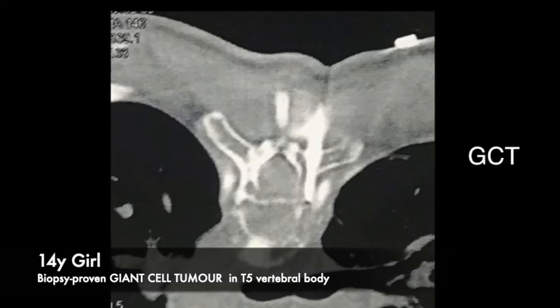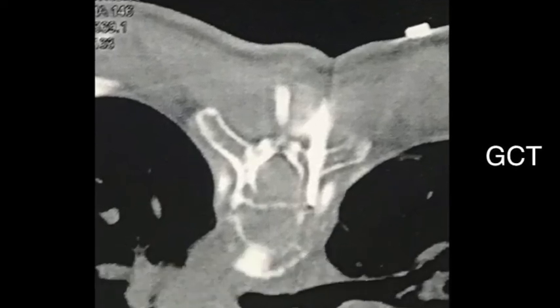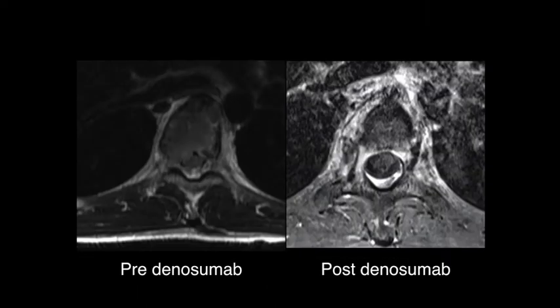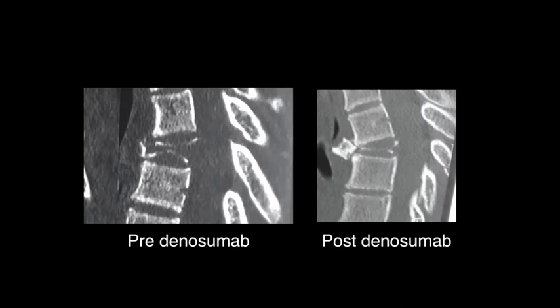This is a 14-year-old girl with biopsy-proven GCT in the T5 vertebral body. The PET scan was negative for metastasis. Three months of preoperative denosumab treatment had resulted in regression of the epidural component of the tumor, and the tumor had also reasonably ossified.